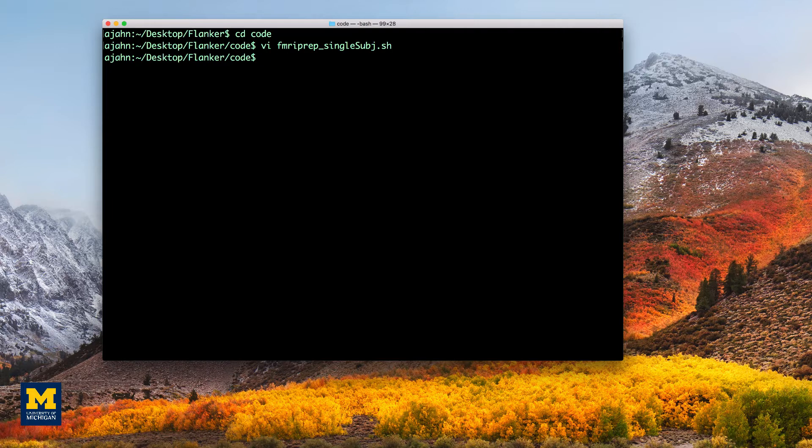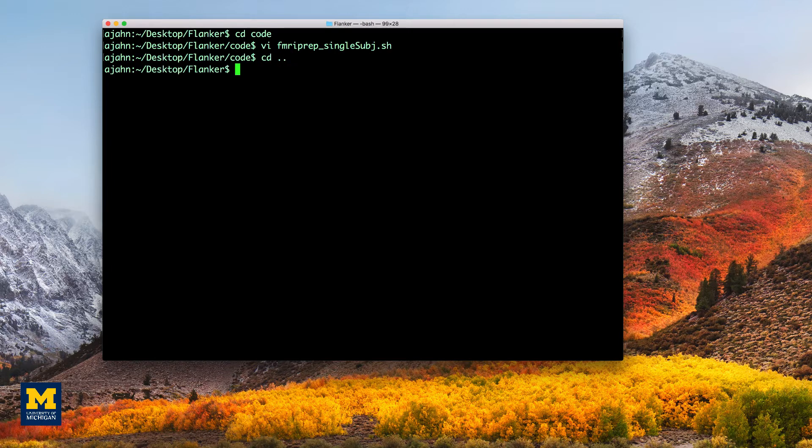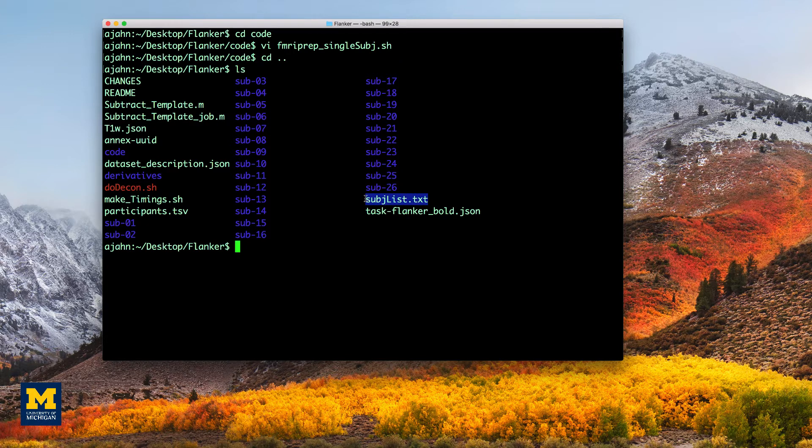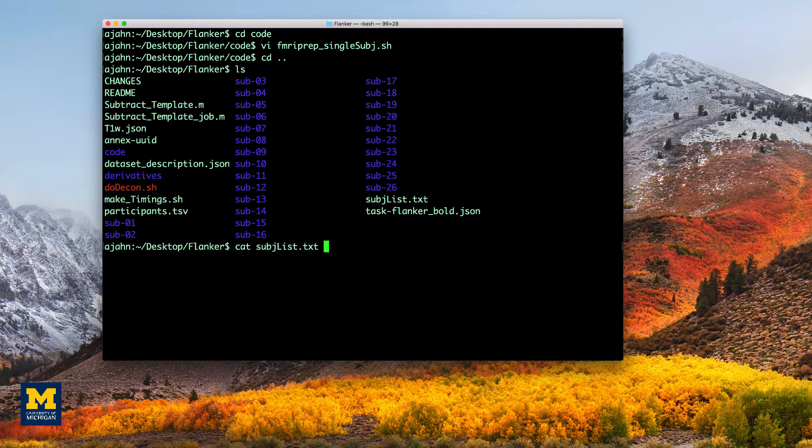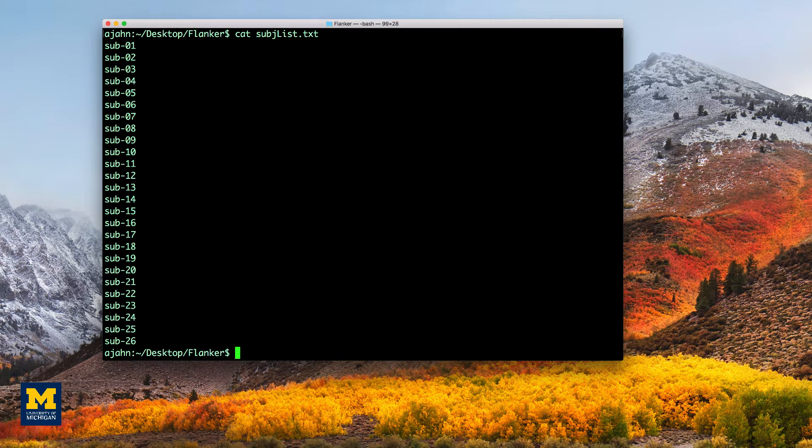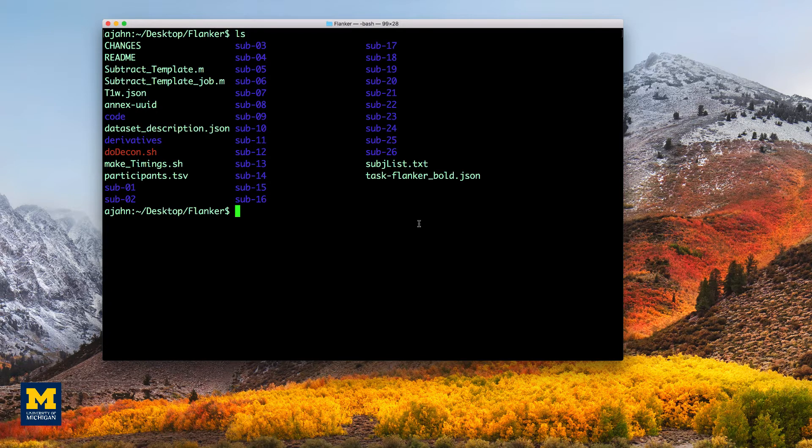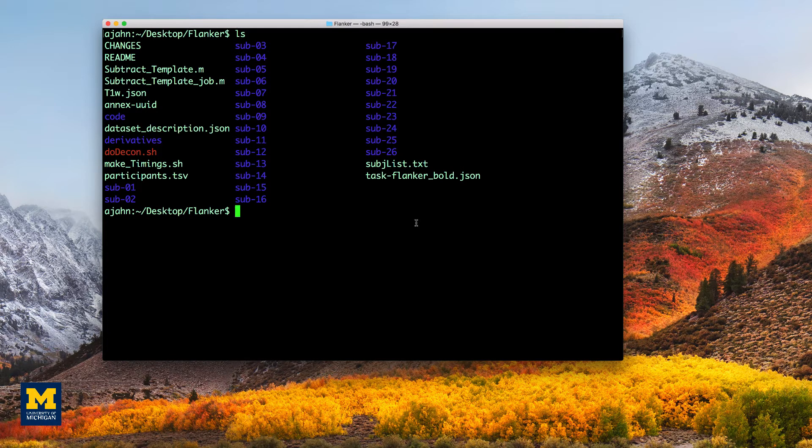To create our for loop, we will simply combine all of the code we ran in the previous chapters, making sure that they are in the correct order. Assuming you already ran the script maketimings.sh, you should already have a file in your Flanker directory called subject list, which contains a list of all the subjects in your study.